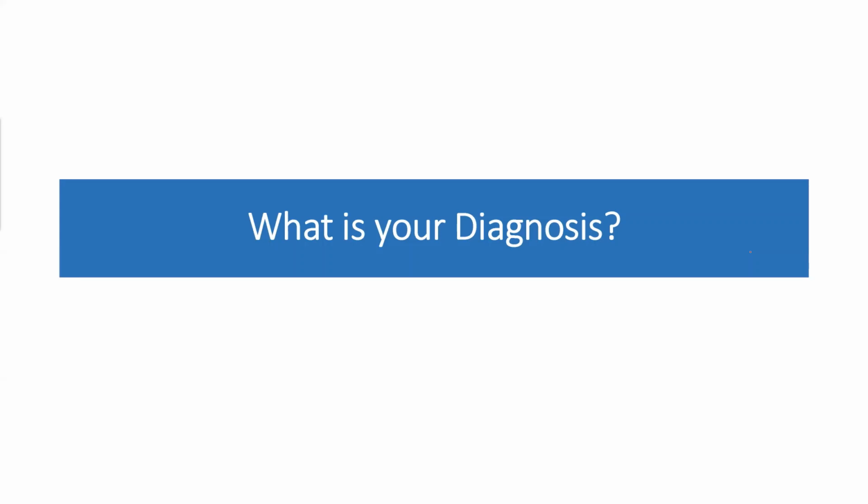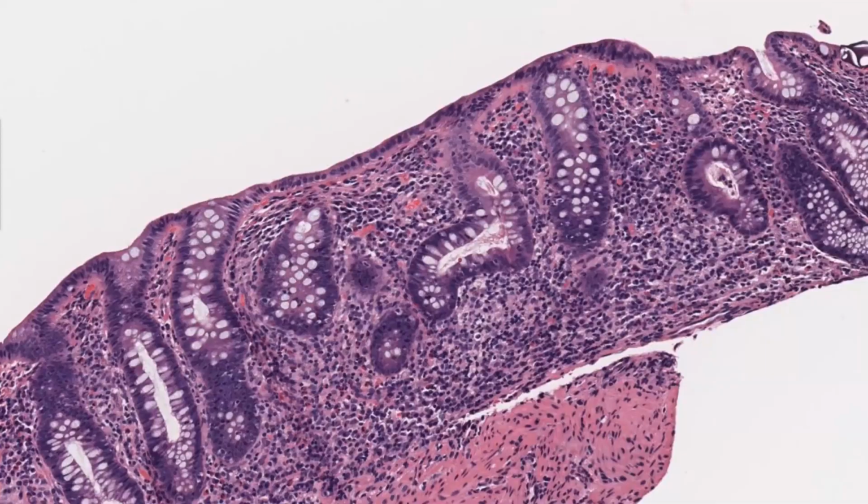That's completely and utterly nonsense, right? And this is what we will discuss next time. No, there is no dysplasia there, so don't go too far. I am not going to show you dysplasia in this slide, so don't panic about dysplasia for now, right? So this is not pouchitis, and this is what we will be discussing next time. I will tell you why a biopsy like this, you should let it go, okay?